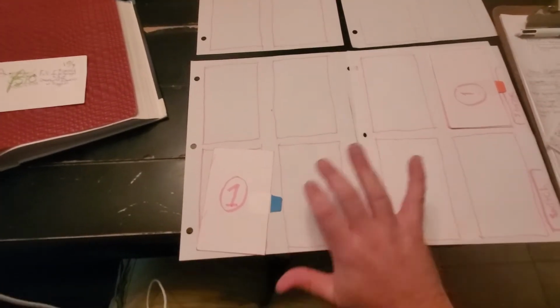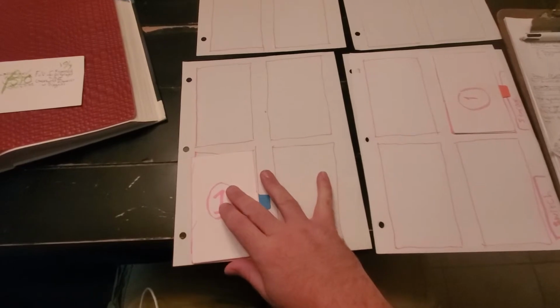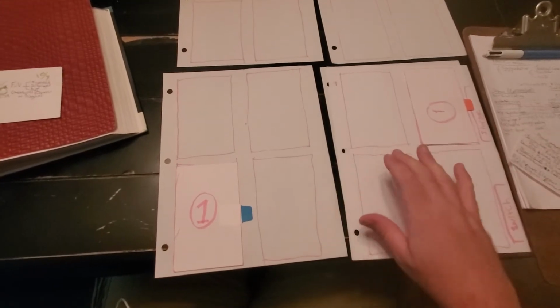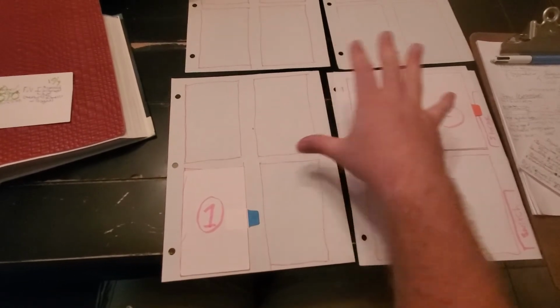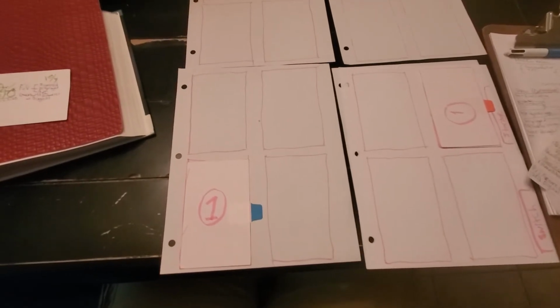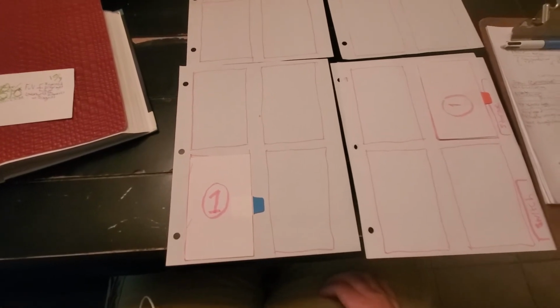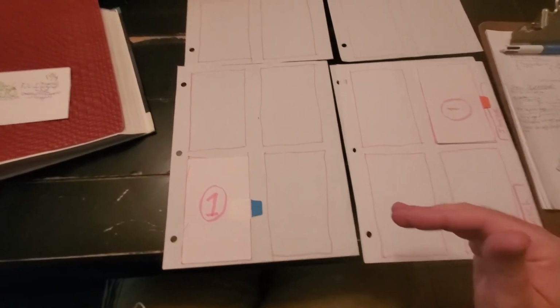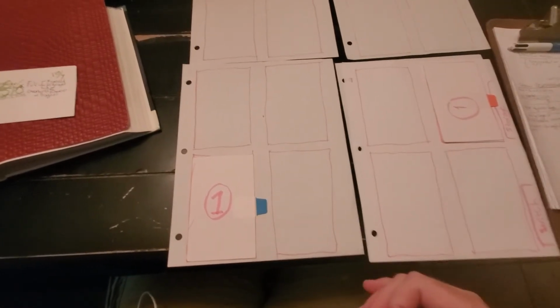And that's how you get your 2D matrix. They're not considering the difference between a pixel and a digital readout. The matrix is both the density and fill factor of all the pixels, right? And it is described as a two-dimensional array of pixels, but it's also an x and y dimension of a picture.